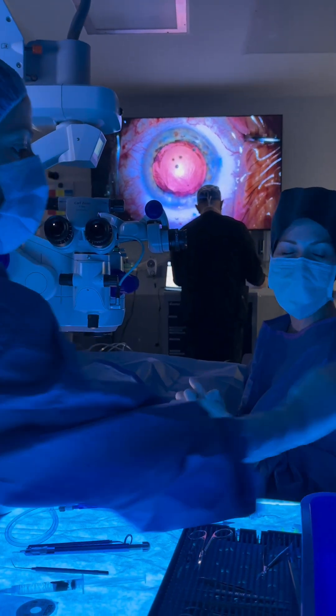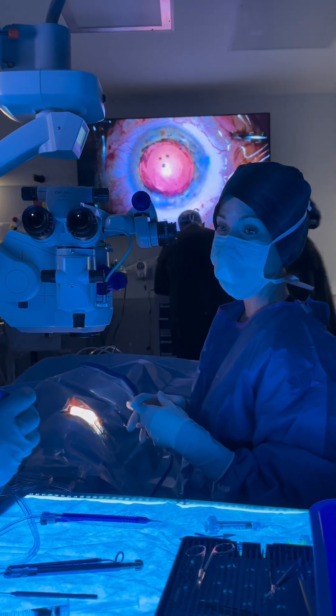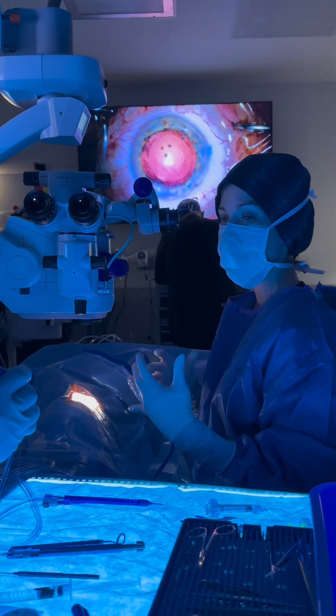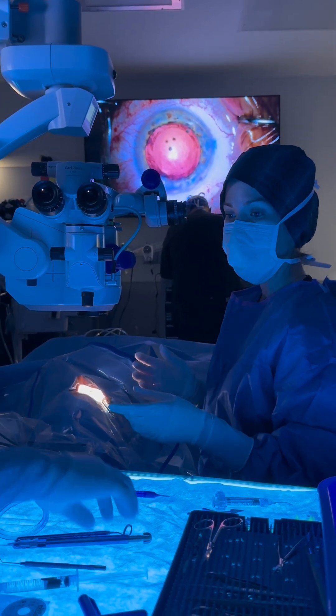This is a specialty lens which is called the Vividi. The Vividi is an extended depth of focus lens, and so that provides a range of vision — you see far away, intermediate, and even a little bit near.